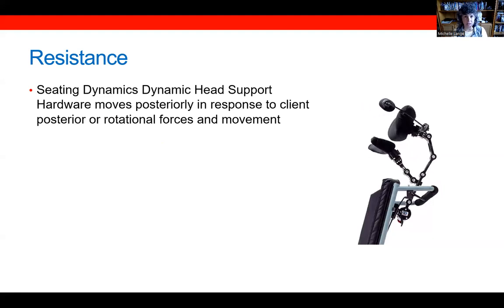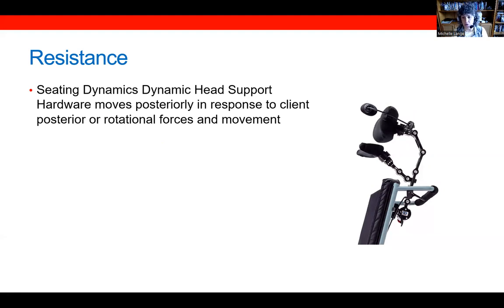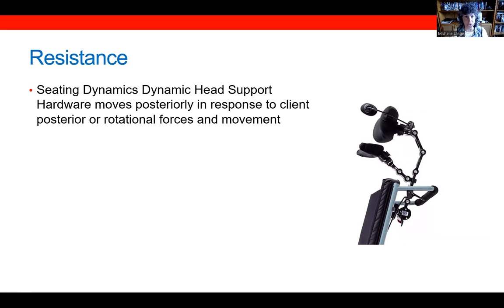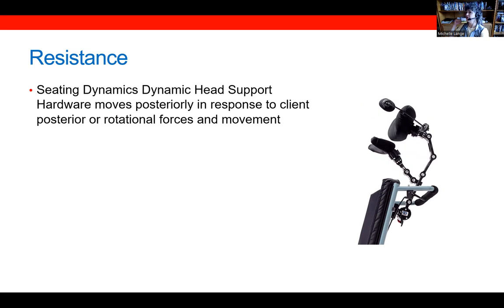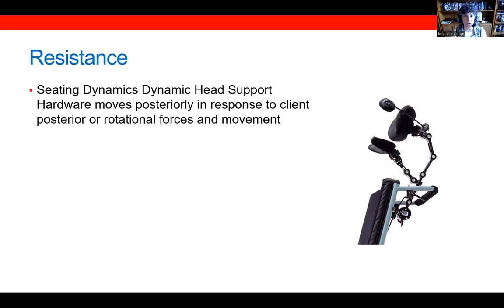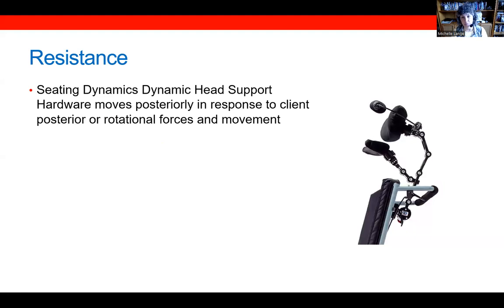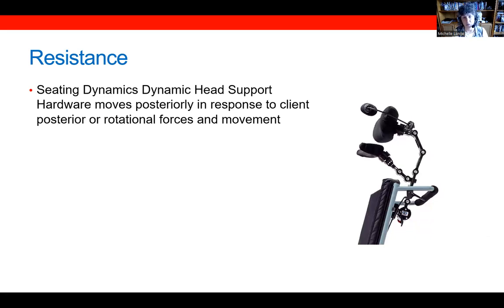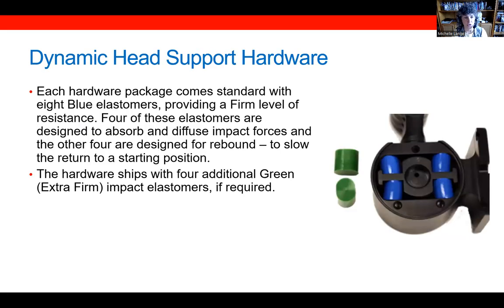Many people, when they extend at the neck, rotate, and some of that can be due to influences like the asymmetrical tonic neck reflex that pull someone into extension as well as rotation. So it's important that if there's any rotation present, the dynamic component can respond to both posterior and rotational forces.